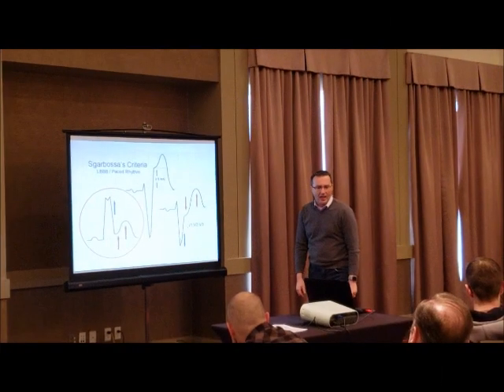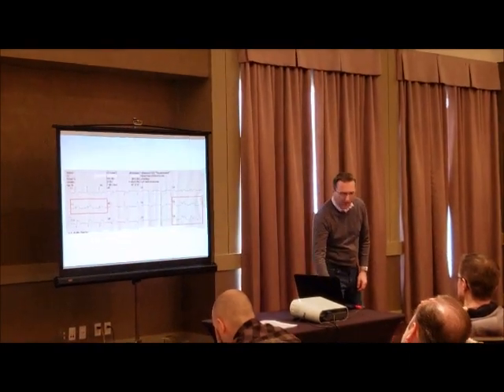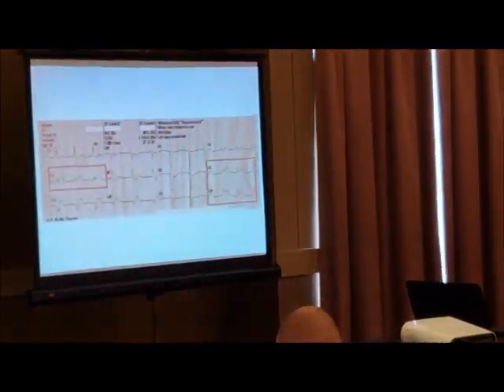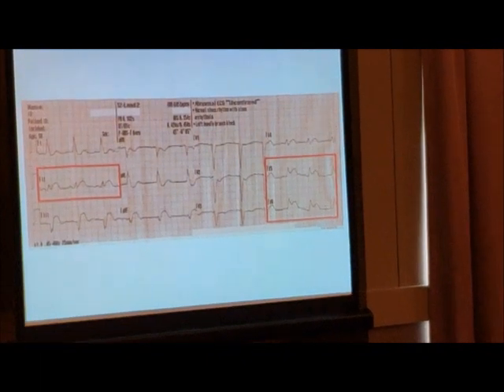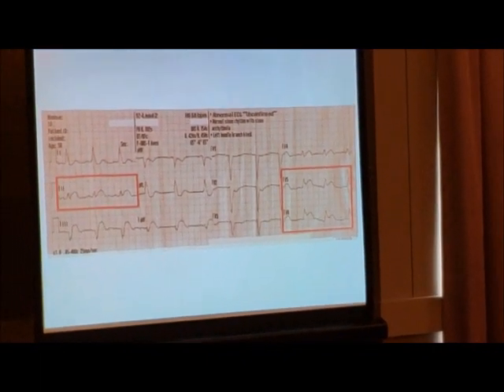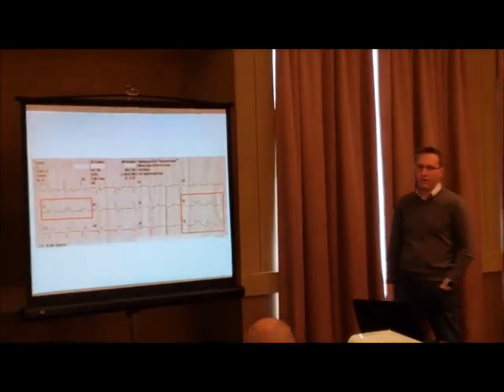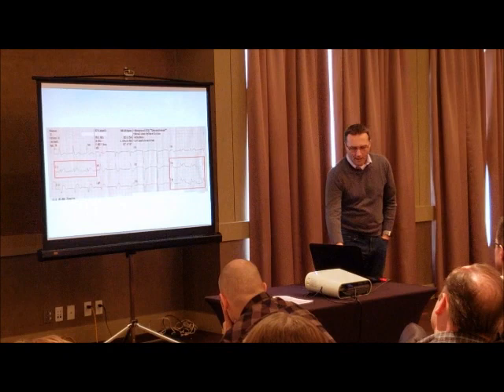And we'll start with concordant ST segment elevation. Is there any ST elevation concordant with the QRS complex on this ECG? Yes. It happens, by my reckoning, 3 times on this ECG: in lead 2, and also in lead V5, and also in lead V6. We have concordant ST elevation, okay?